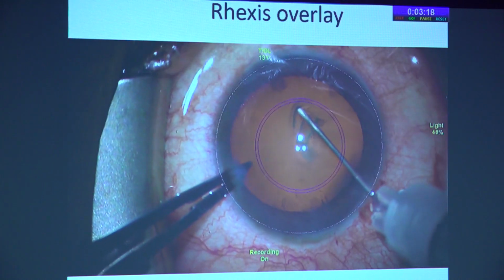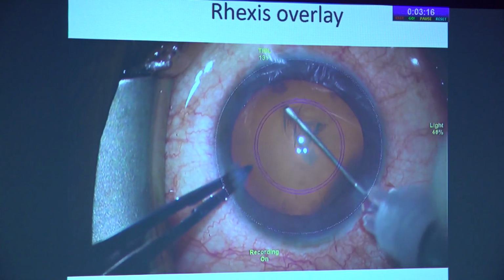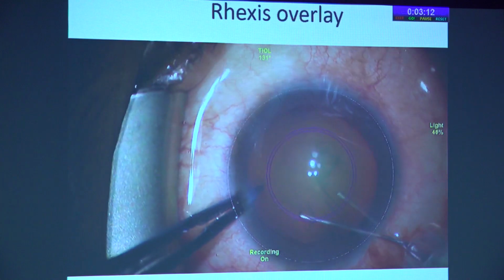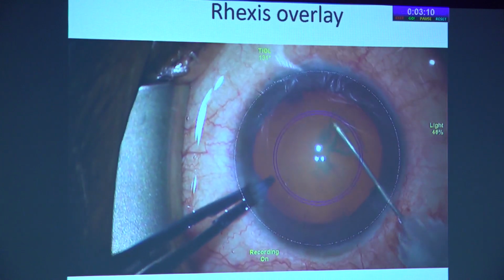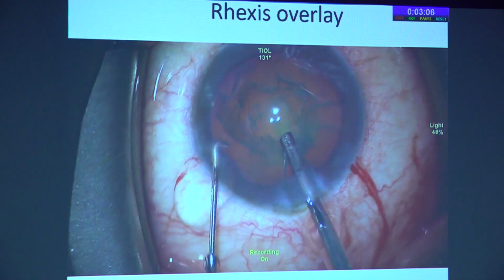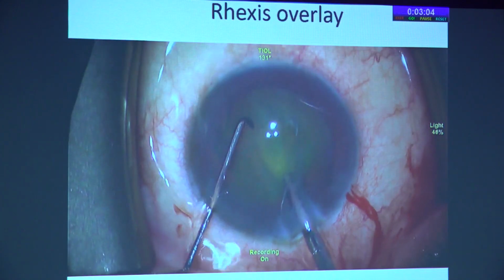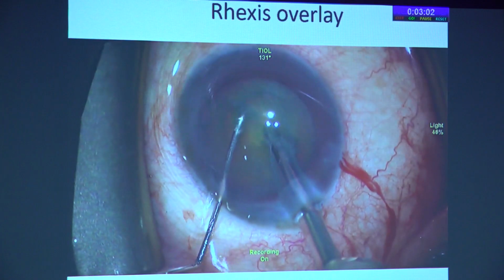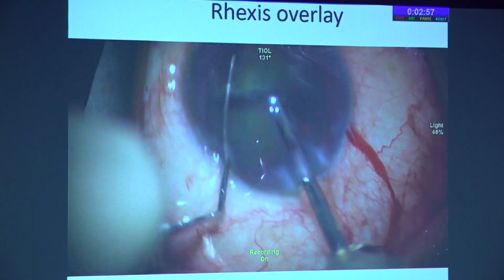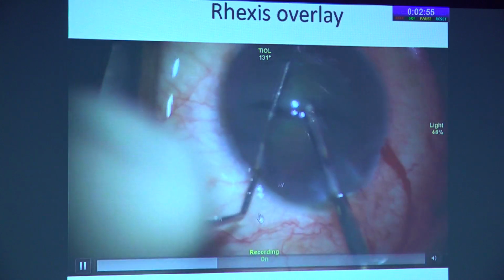The inner circle is about 5 mm, the outer circle is 5.5 mm. So you might think to yourself, okay, I'm an experienced surgeon, I don't need this overlay mark, I know how to make a 5 mm rhexis. But believe me, once you try this, it gives you consistent results and gives you a very, very well centered rhexis, which will be very helpful in getting your toric IOL stable. And you can be sure that the chance of the toric IOL misaligning will be very low. So this is a routine phacoemulsification.